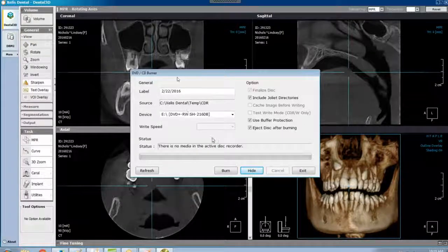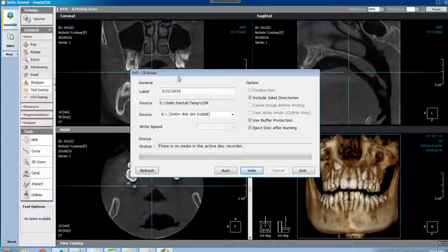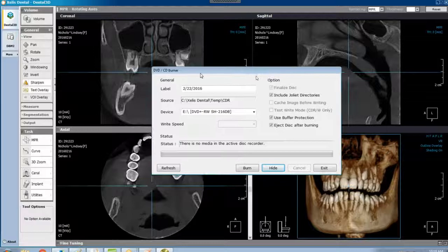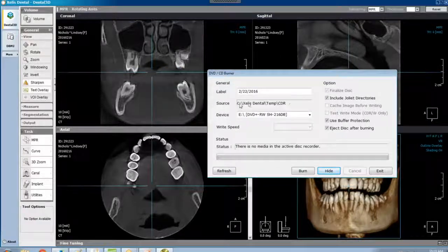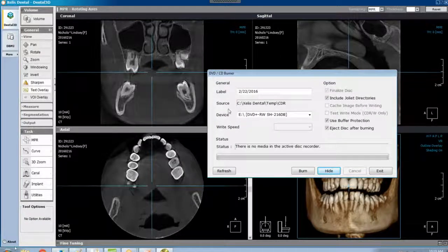You can scoot this off to the side. Your focus is following the source path, this source path.